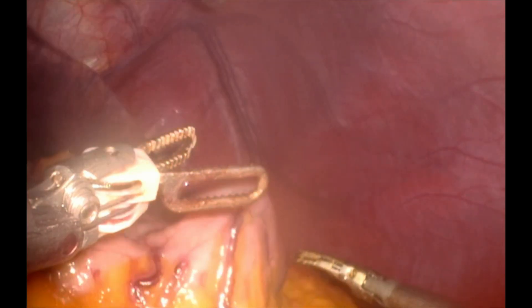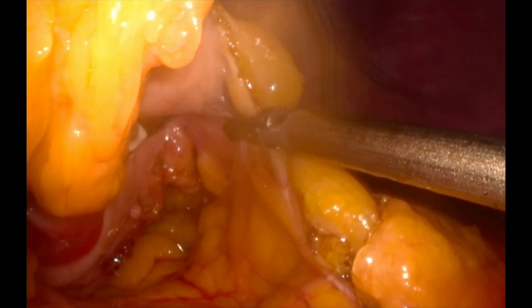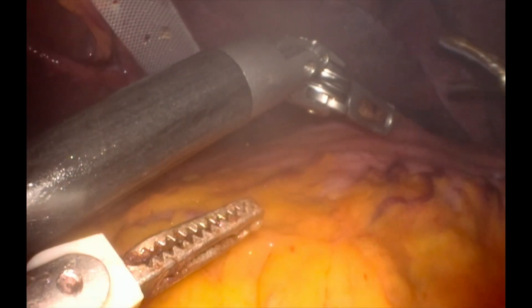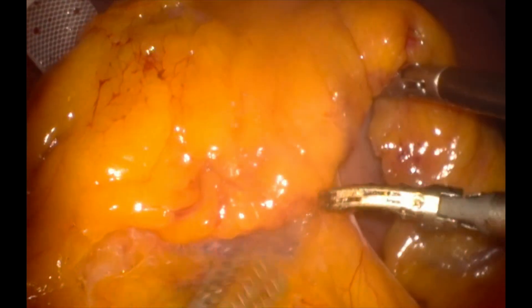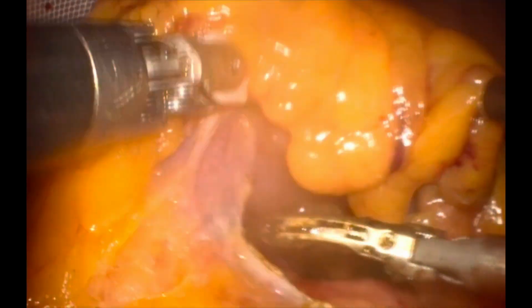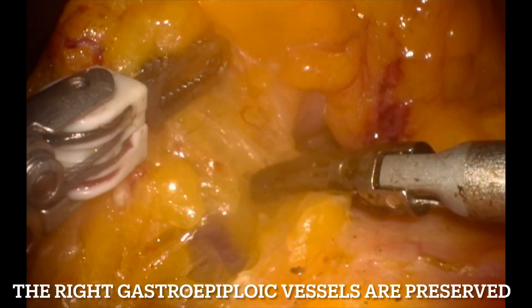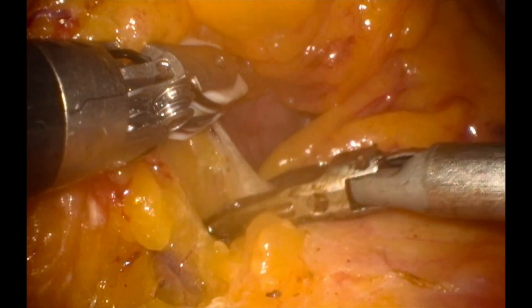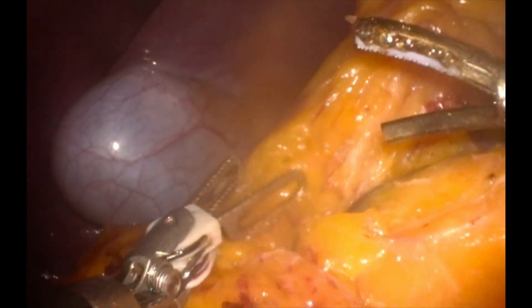Once the dissection is done superiorly, you will be able to connect with the dissection done previously from posteriorly along the G-junction. We then come down near the pylorus and start our dissection in a retrograde way from antrum, pylorus, and duodenum, so that enough stomach is mobilized. Be careful — the right gastroepiploic vessel, which is the pillar vessel supplying the entire stomach tube, will be here. You have to take care not to injure it while mobilizing the stomach tube enough so that it will reach into the neck.